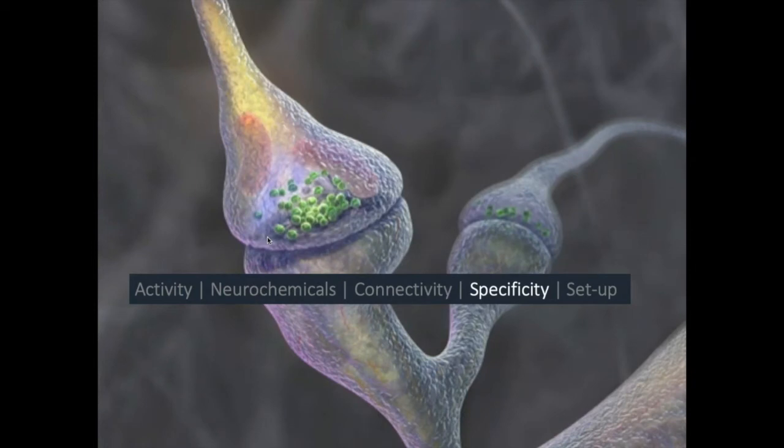And then to ask a slightly geeky, but hopefully vaguely interesting question about if brain regions change their connectivity by changing the phase and the frequency of the activity in individual brain regions, how are they doing that? What's the mechanism by which they can change that connectivity pattern? And those two questions are really only possible if we start using stimulation in the scanner.